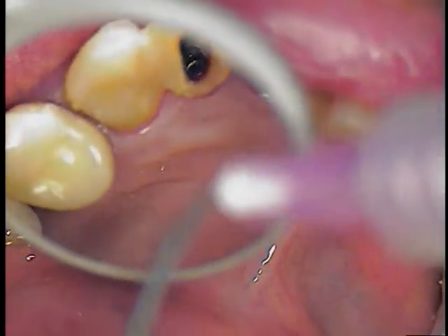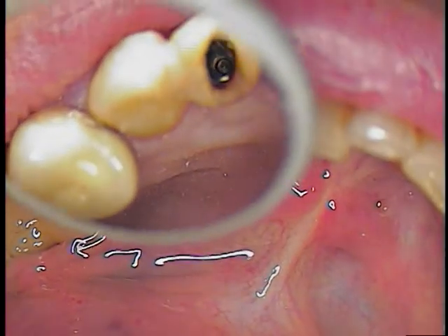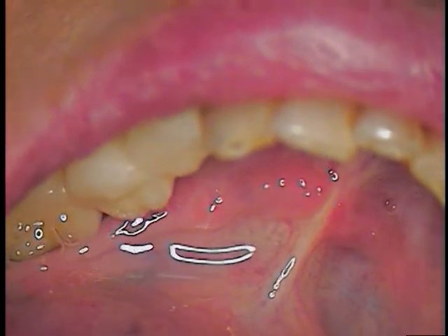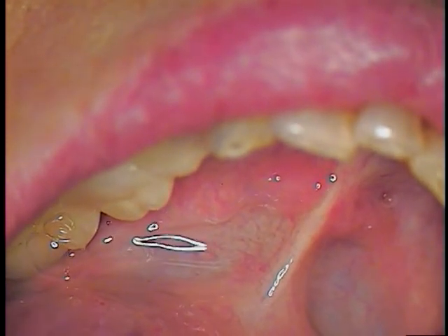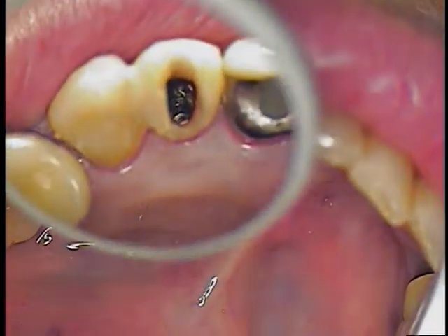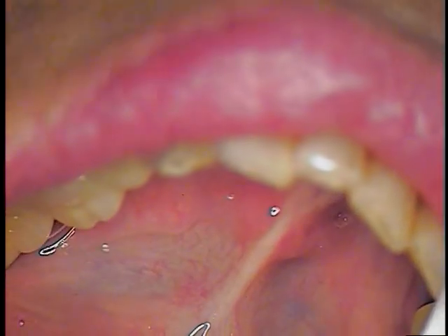Okay, hang on. I need a small suction tip. Yellow. I'm going to put a red tip on this, please. Okay, so what I'm going to use now is tartar and stain. Just as a precautionary measure, we're going to use a brush so that I don't inject a lot of this material because it is a mild acid.